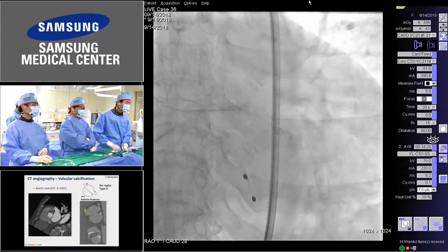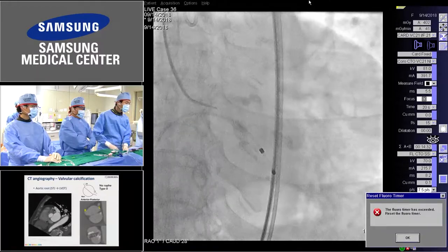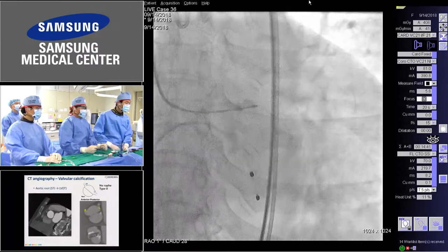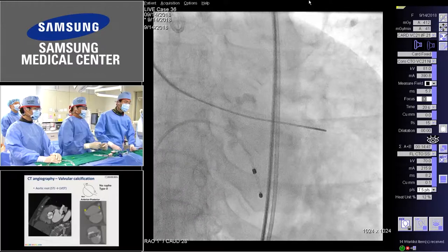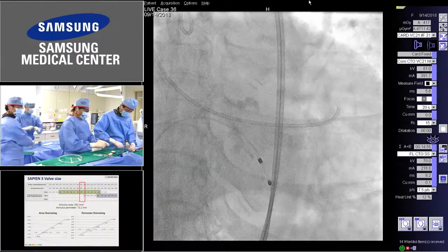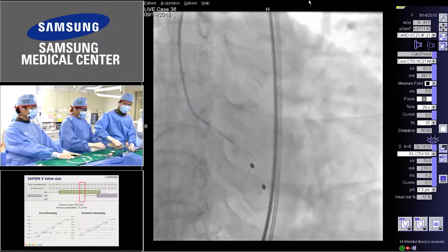Okay. But in regard to the size itself, this is a bicuspid valve, and the selection of the Sapien 3 is a small sizing. It's just the 23. So if you deploy the 23 in the bicuspid valve, the achieved valve size is much smaller. So, do you think so? In such cases, maybe I'd like to consider the formation of the valve structure as more supraannular. I'm still learning that issue you suggested.